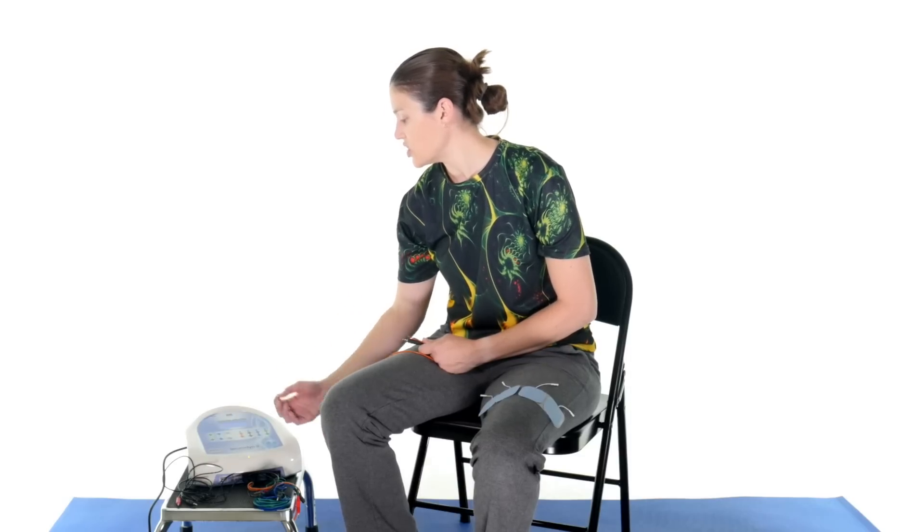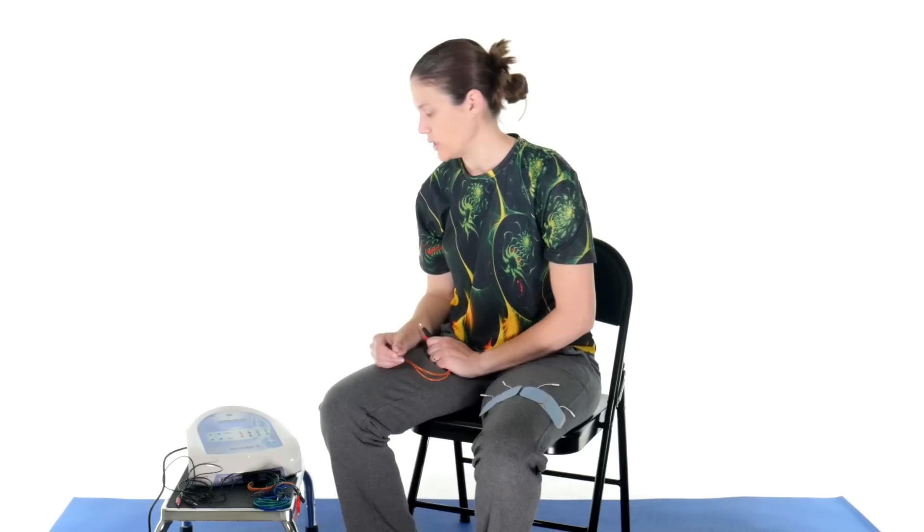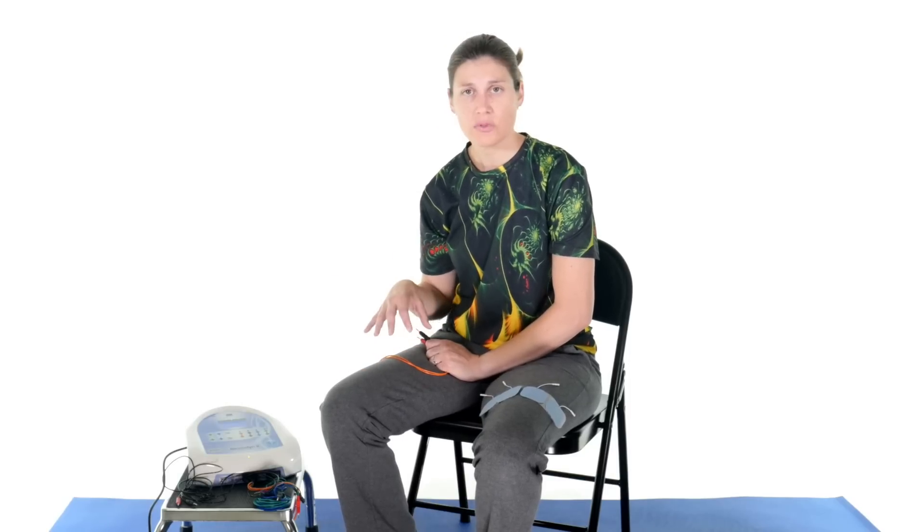You can set all these parameters depending on whether you're doing TENS, Russian current, or FES. With TENS, you can choose a normal conventional mode — ramping slowly up and down — or a burst cycle mode, which changes the current so your body doesn't adjust and adapt to it. All those settings are really useful and change depending on what you're using it for, the patient, the type of injury, and so on. Make sure you do your research and find the best parameters for your specific use case.